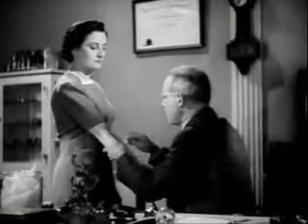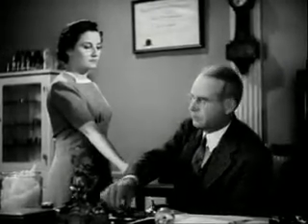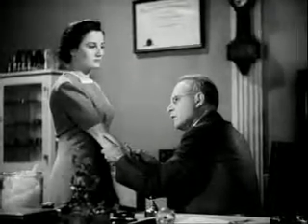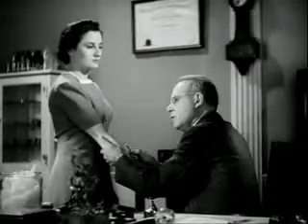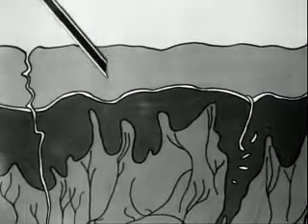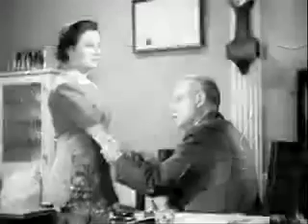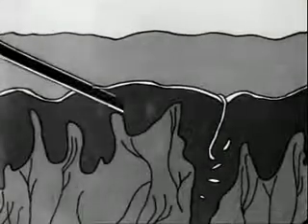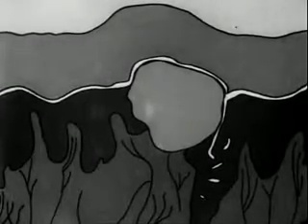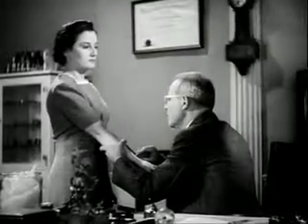Cleanse the forearm with 95% alcohol. Insert the needle intradermally. This is important, for if the solution is injected under the skin, no skin reaction may result. Here's a diagram to make this point clear. This is the wrong way. If done like this, the right way, a small white wheel will rise over the needle point. Hold the needle almost parallel to the skin as it is inserted. Inject 1/10 of a cubic centimeter of the tuberculin solution.